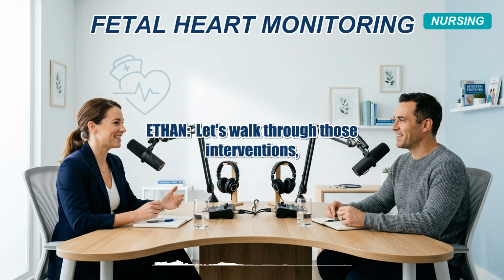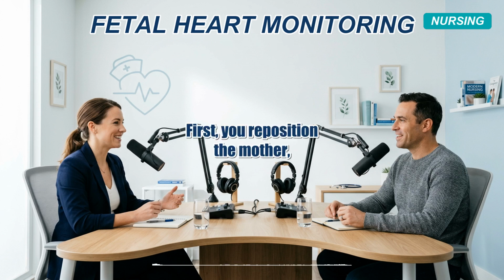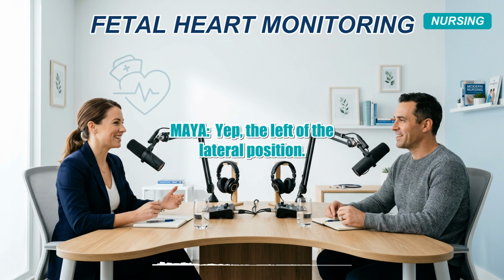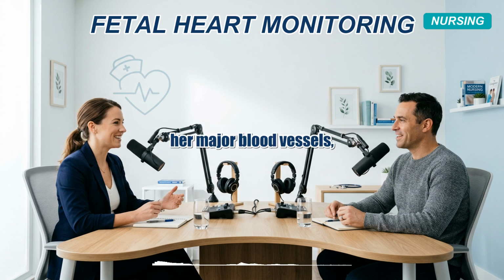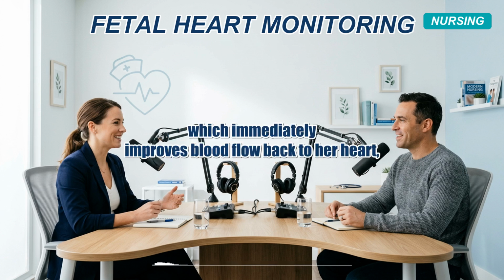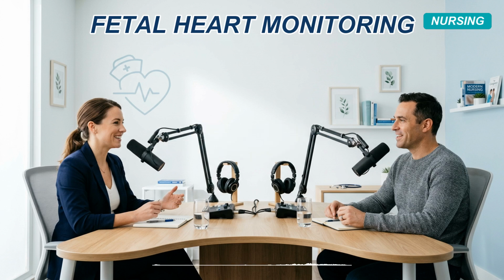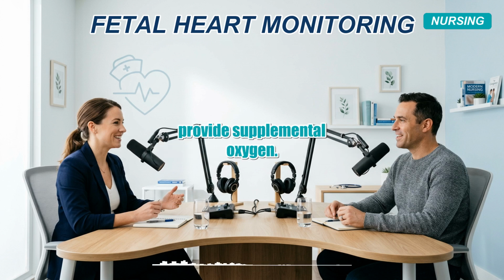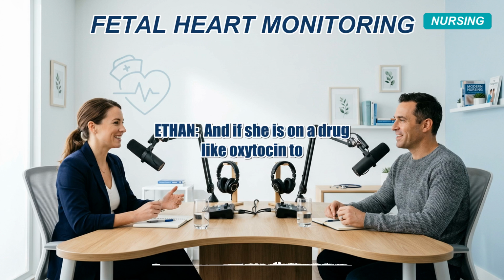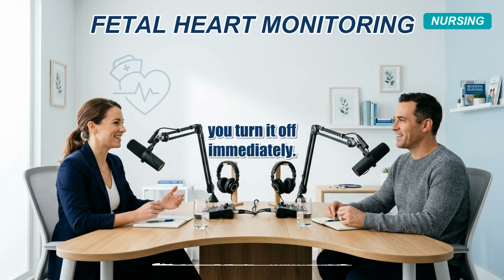Let's walk through those interventions because the logic behind them is brilliant once you understand the mechanics. First, you reposition the mother, usually rolling her onto her left side. Yep, the lateral position. Why? Because you are taking the weight of the uterus off her major blood vessels, which immediately improves blood flow back to her heart and therefore back to the placenta. Next, you administer IV fluids to boost her blood volume and provide supplemental oxygen. And if she is on a drug like oxytocin to stimulate contractions, you turn it off immediately.